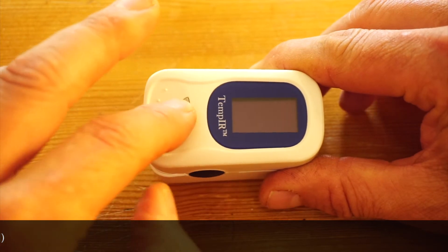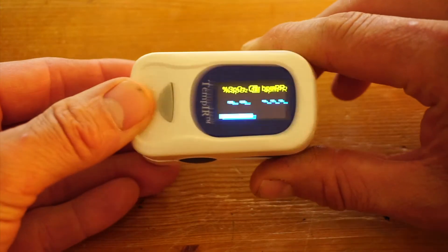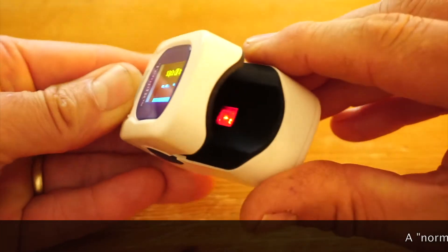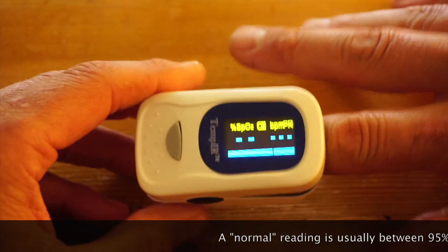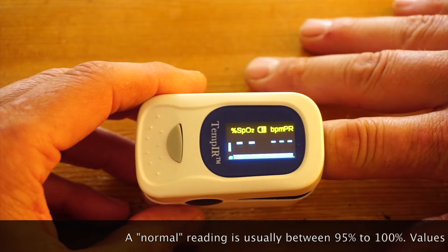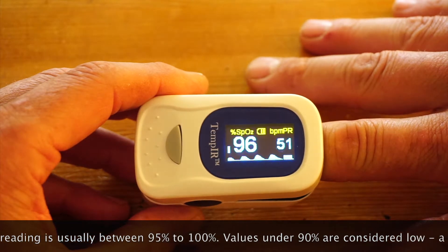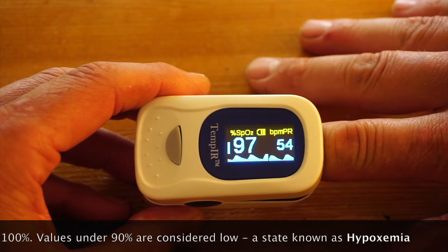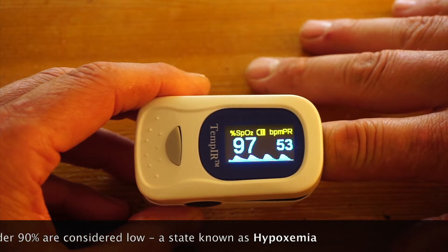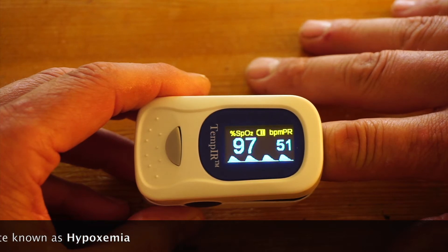Just press the button to turn the pulse oximeter on and within a few seconds the device is ready to take your first SpO2 reading. The two blue figures on the left-hand side show your percent SpO2, and on the right-hand side the pulse rate in beats per minute.